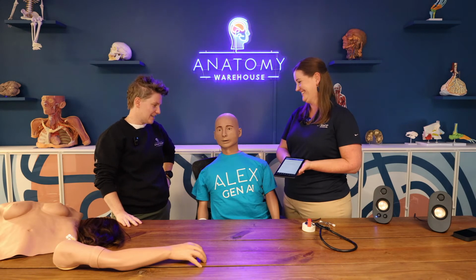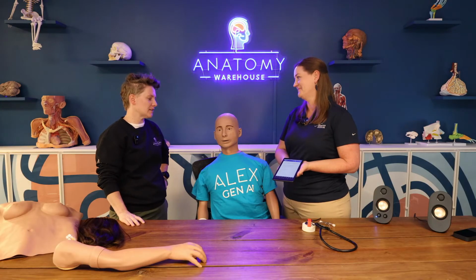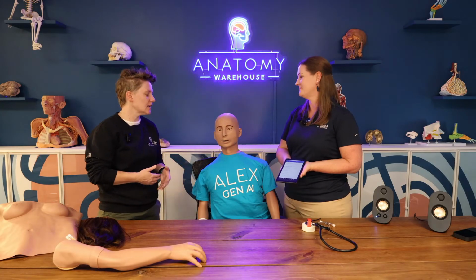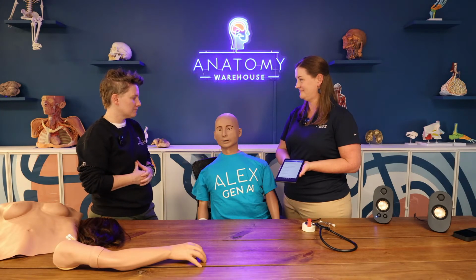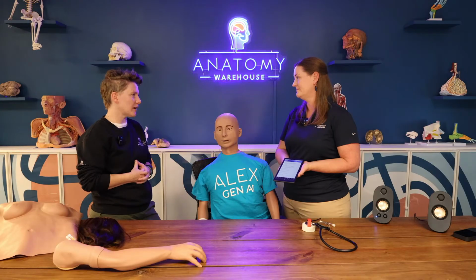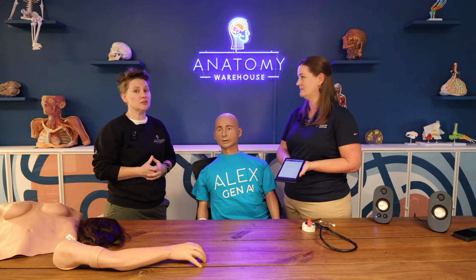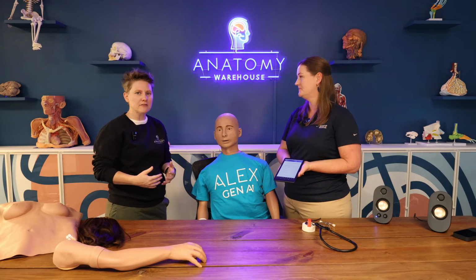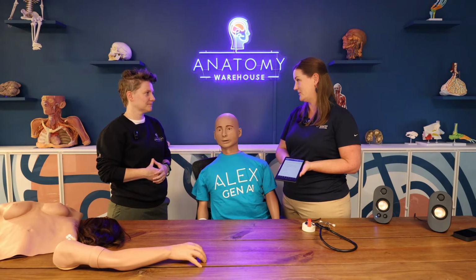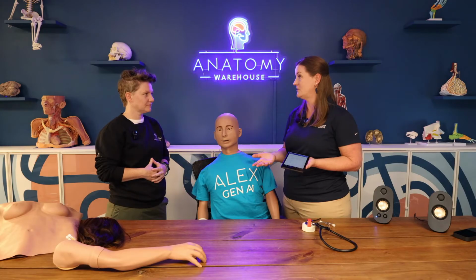Right. And I think it's so cool that you guys are really bringing AI into the simulation environment, so that we can, again, practice the soft skills that are really necessary between the patient and the healthcare professional. Bedside manner is something that I think we really want to make sure we're encouraging in a simulation environment. Empathy is, I think, how we create a safe place for patients to fully describe their scenario, how they're feeling, and it's so important that we practice that. Right. A person walking into the clinic is more than just their diagnosis. The goal, of course, is to figure out how to treat them and take care of them, but they are absolutely more than just that diagnosis.